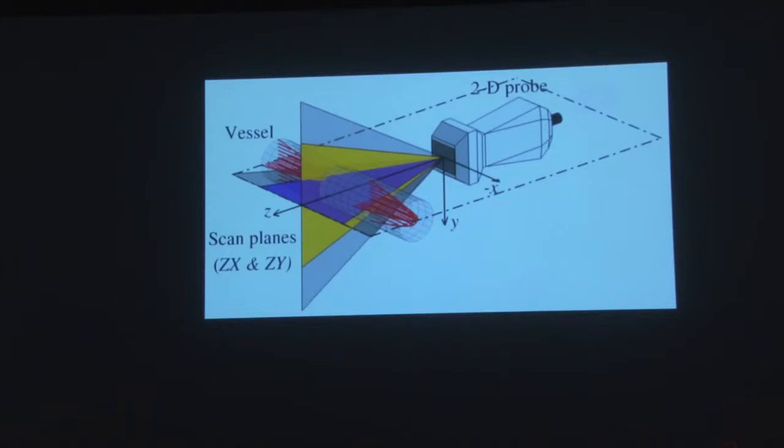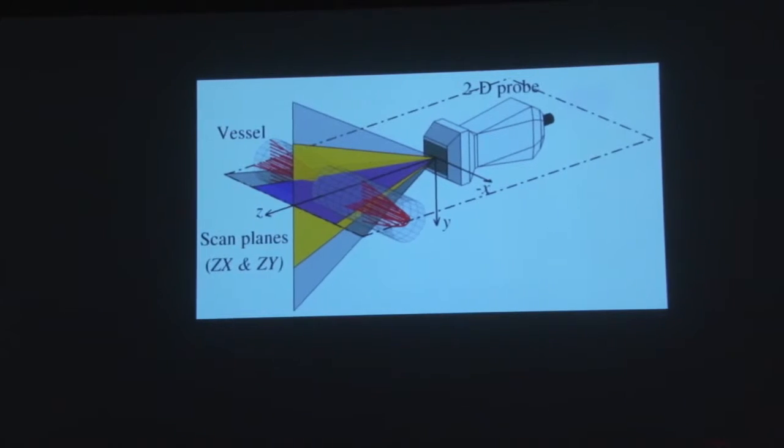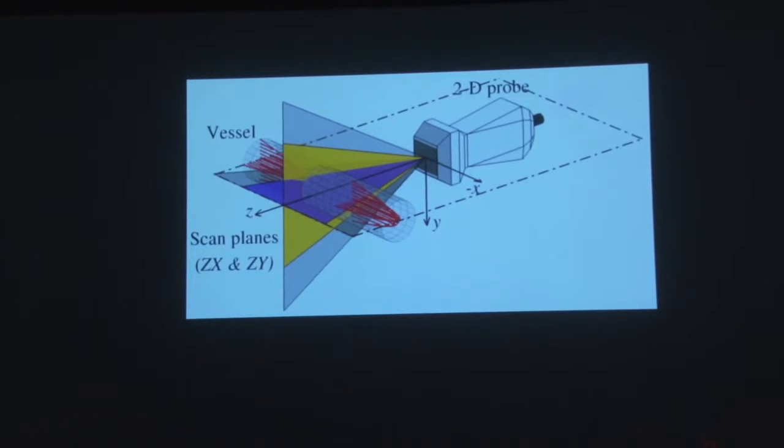And we have had different kinds of vessels: artificial vessels, mimicking tissue-mimicking vessels, and then real in vivo vessels. So if we have a vessel here and we have it perfectly aligned, so we have a cross-sectional plane and a longitudinal plane, what will actually be coming out of the yellow plane, which is the cross-sectional plane, is this 2D circular symmetric profile. Because if you have a really long tube and a viscous fluid, and it's laminar, it will be fully developed, so we'll get this 2D parabolic shape.